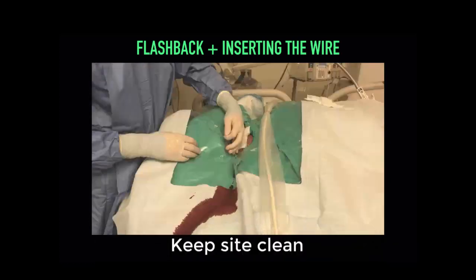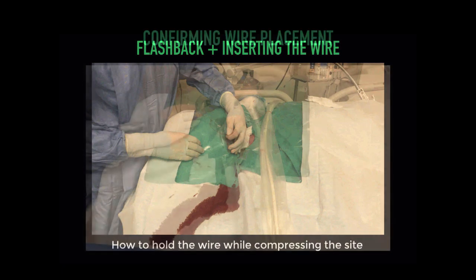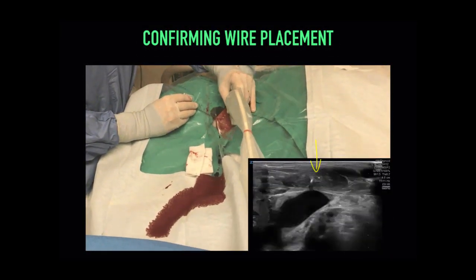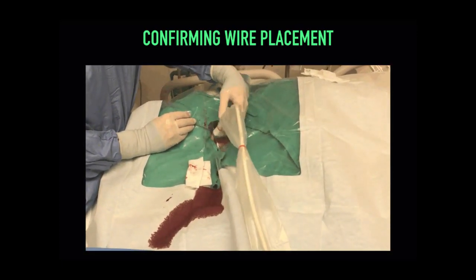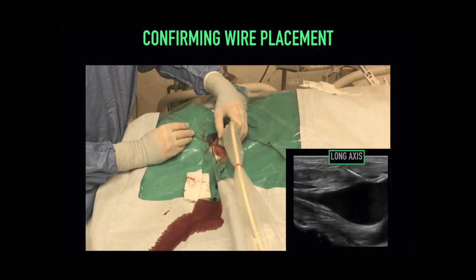Ensure to keep the site clean. At this point in time, you can hold the wire with the knife side of your palm to compress the site, but also to simultaneously bend the wire in preparation for the next steps. Again, anytime the wire is bent, be careful not to kink the wire. Next, ultrasound can be used to confirm wire placement in the short axis, as shown here, all the way down to the brachiocephalic trunk, and also in the long axis. This helps to affirm that your wire is indeed in the venous vasculature.